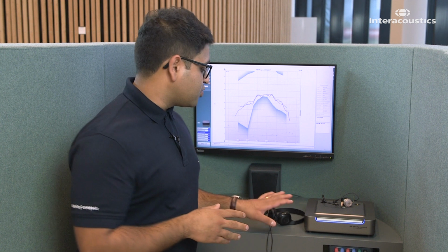It also has a second application, where you can use this monitor headset and give it to the patient's support. This helps to involve them in the hearing aid fitting process much more in depth, and as well explain and perform that counselling in a much better way, especially when you're trying to explain the benefits of different hearing aids.